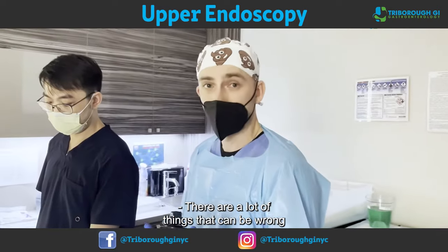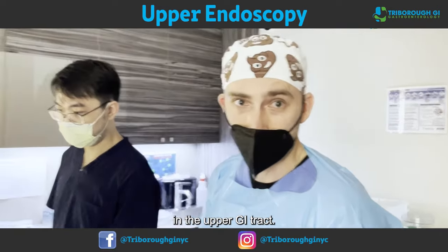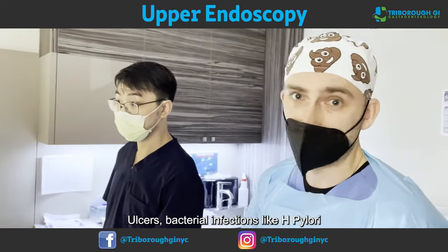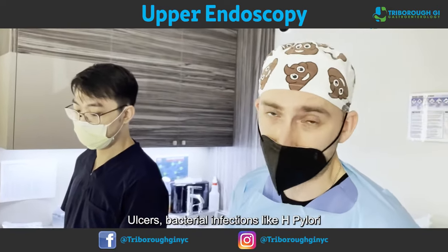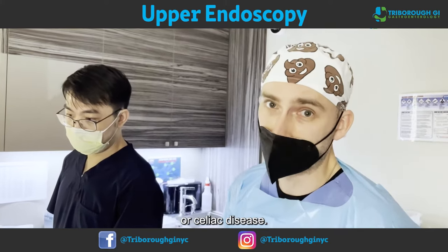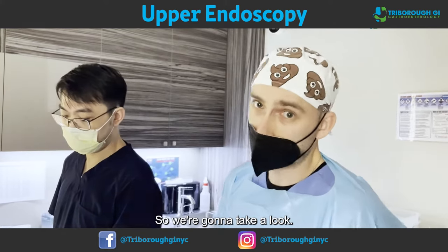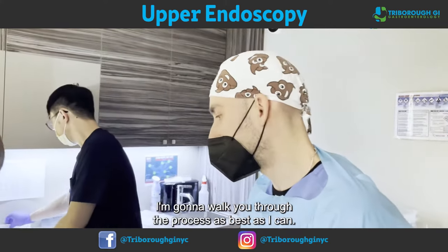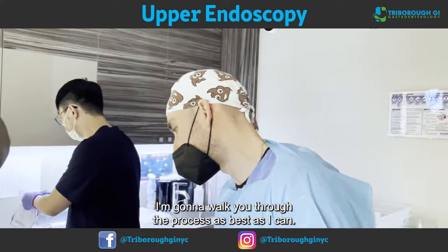There are a lot of things that can be wrong in the upper GI tract — ulcers, bacterial infections like H. pylori, or celiac disease. So we're going to take a look, and I'm going to walk you through the process as best as I can.